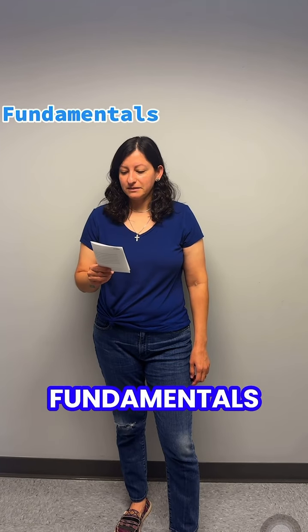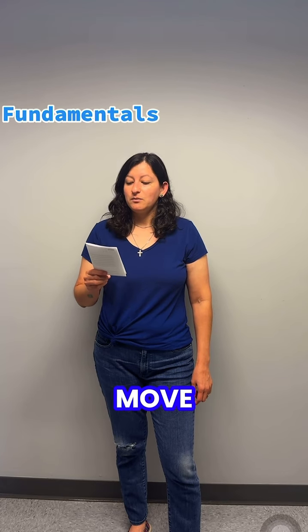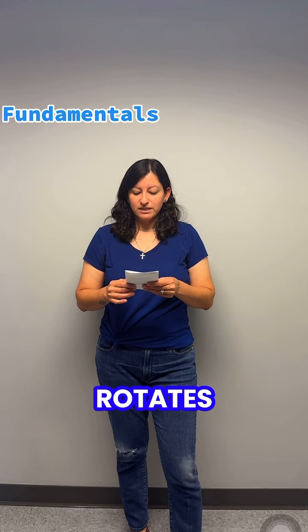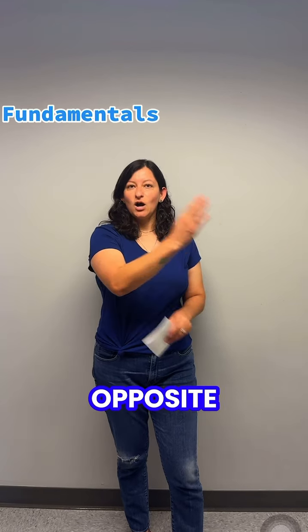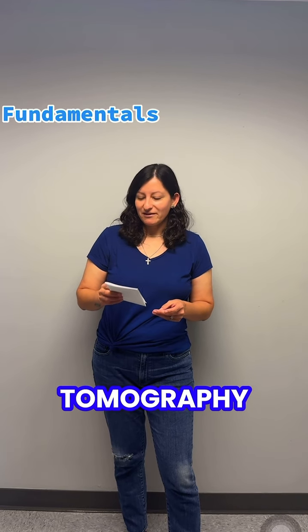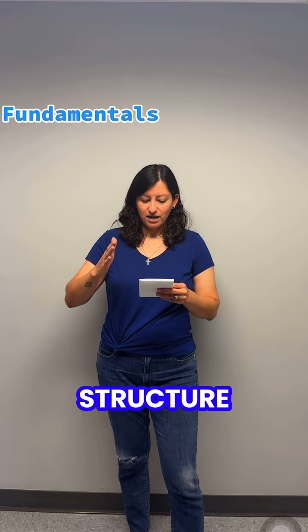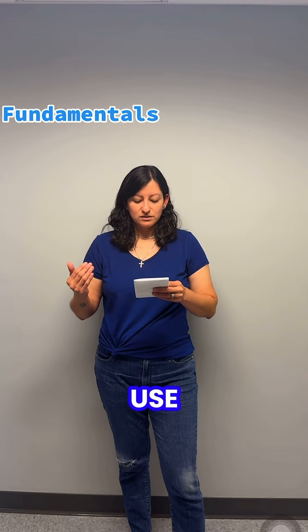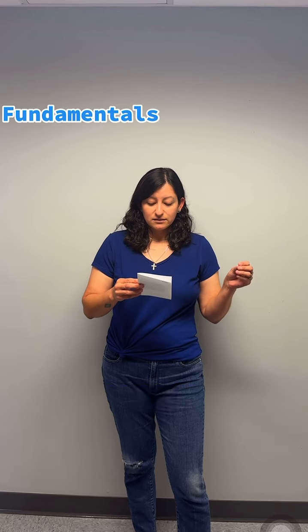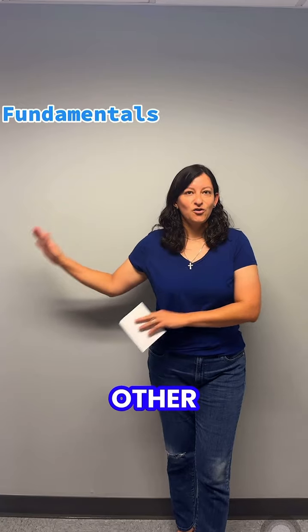Alright, these are the panoramic fundamentals. In panoramic imaging, the receptor and the X-ray tube head move around the patient. The X-ray tube rotates around the patient's head in the opposite direction. This process is called tomography. Tomo means a view of a slice of structure, and graphy means the use of examining. Imaging of one section while blurring images of structures in other planes.